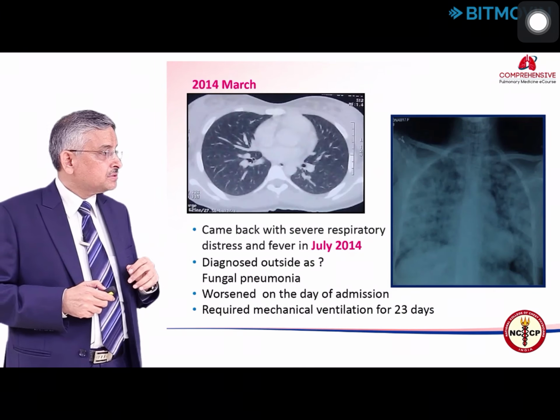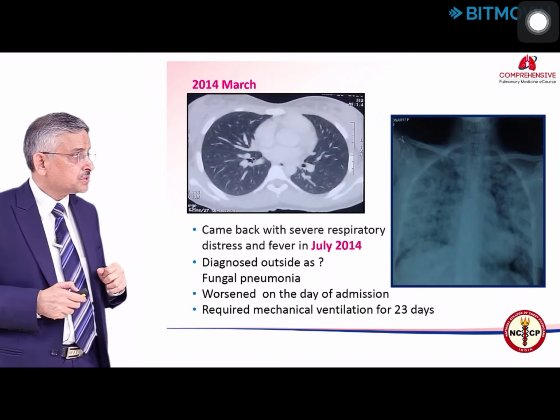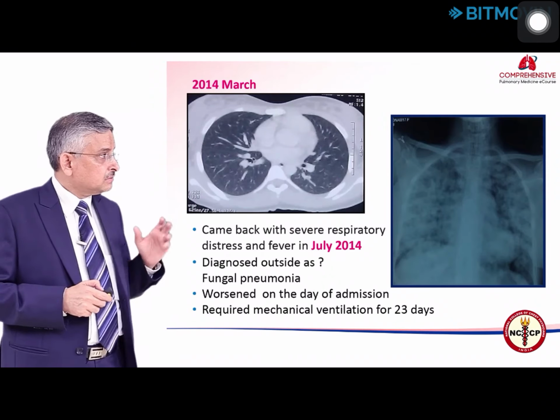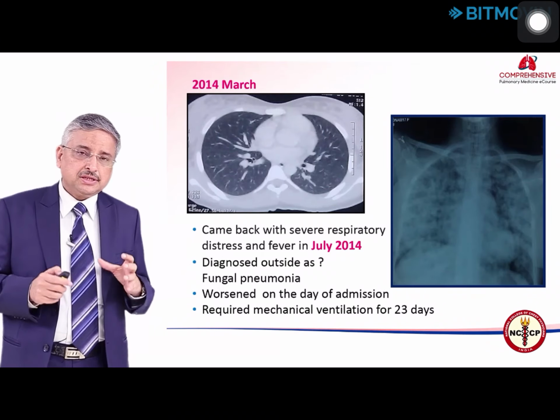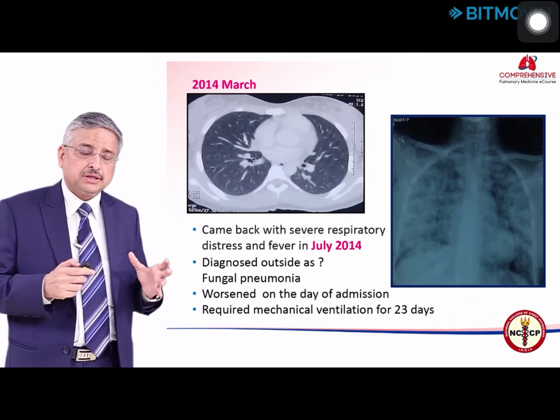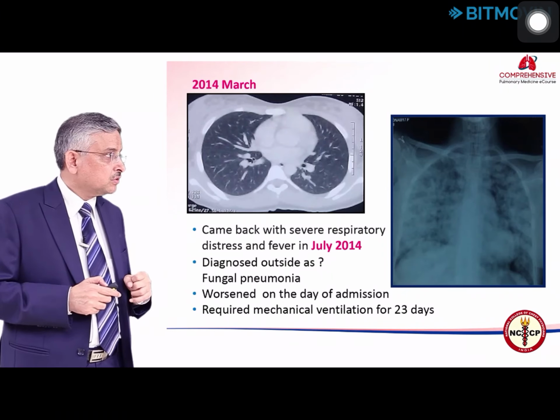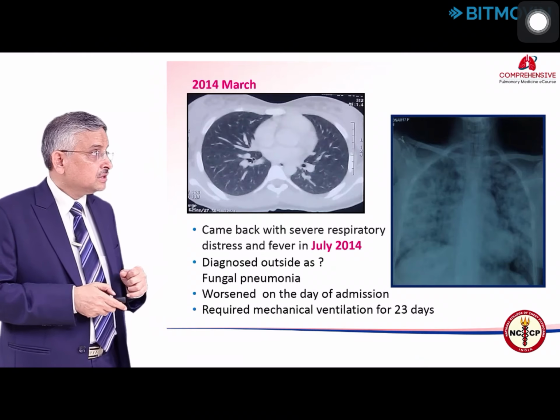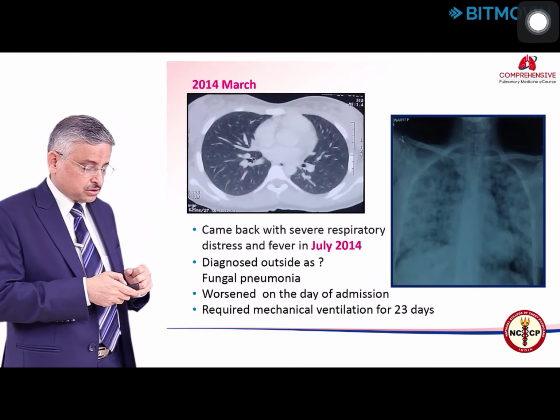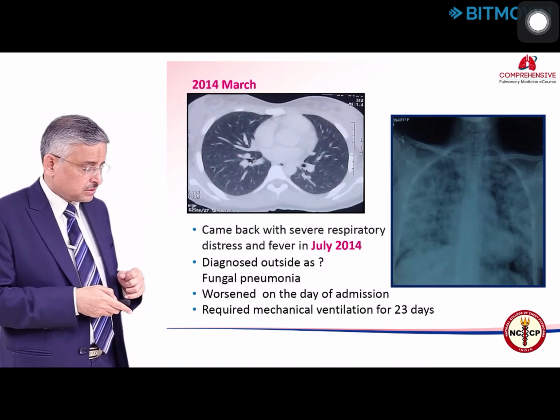In July 2014, she had severe respiratory distress and fever. She was diagnosed outside as query fungal pneumonia, and worsened on the day of admission. As a matter of fact, she came to the OPD, she was very breathless. I admitted her immediately, and by the evening, when I went for the evening round, she had been intubated. She had gone into severe breathlessness and she required mechanical ventilation for 23 days. This is the X-ray that she came to us with, and you can see these diffuse alveolar shadows present in both the lungs.